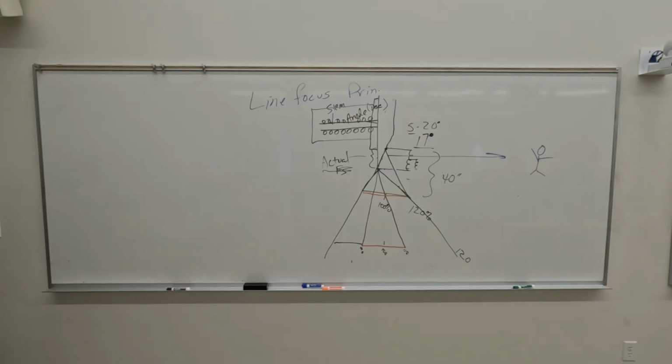How can you tell which side is the cathode end and which is the anode? Good question. You can look on the X-ray tube housing, and a lot of X-ray tubes are going to be marked. It may say cathode and anode, and it might instead have a plus and a negative. So the plus would be the anode end. Yeah. Either one of those two, and on some of them the stickers have come off.